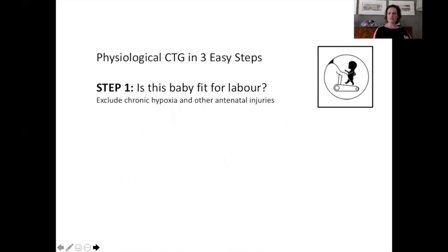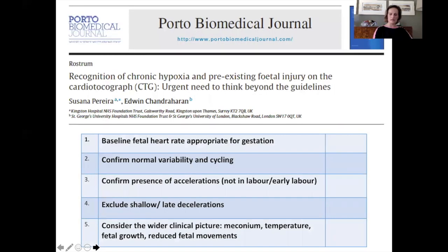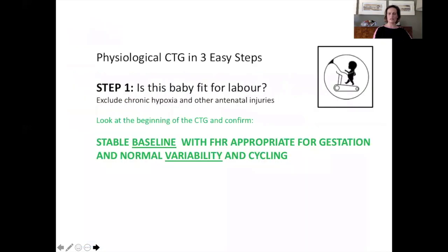Let's start with step one: is the baby fit for labor? This is something you need to address in the beginning. When working with shift work and coming across women already mid-journey or at late stages of labor, it's always important to consider the beginning. At the beginning you look at baseline, variability, presence of accelerations, and you want to exclude shallow or late decelerations. Most importantly, confirm a stable baseline with a fetal heart rate appropriate for gestation, and normal variability.